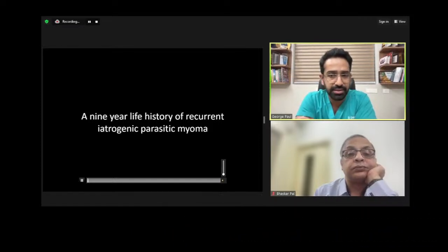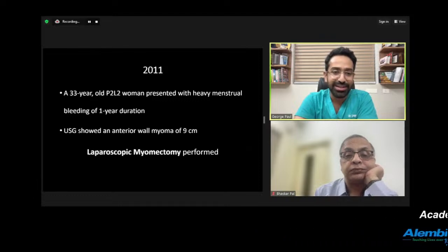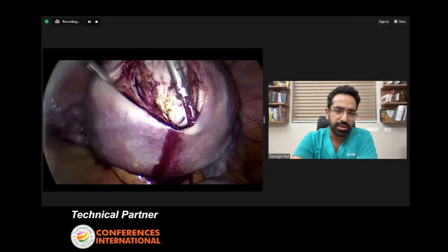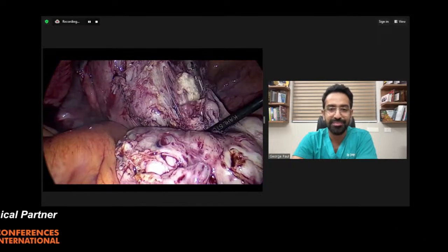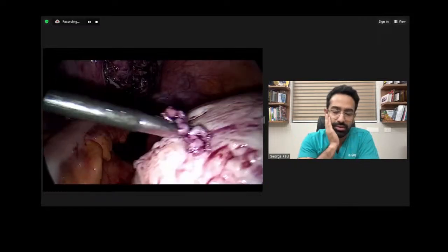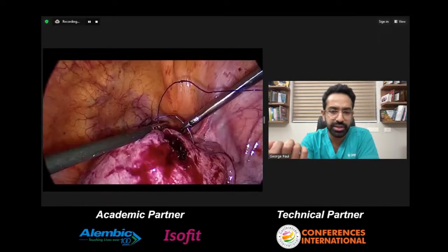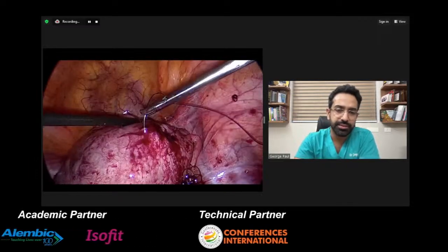So this was a case. In fact, we had operated on her thrice. This was the first surgery in 2011. She had a 9 centimeter myoma, and this was the time where we were doing uncontained morcellation. We didn't really expect the incidence of parasitic myoma becoming so big. So during the time we were doing uncontained morcellation, we enucleated in a traditional way. We used a harmonic, and then we sutured the myometrium with barbed suture without much difficulty.